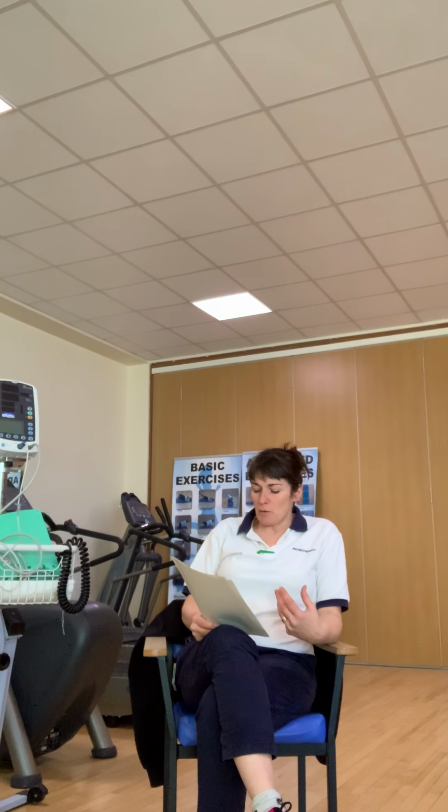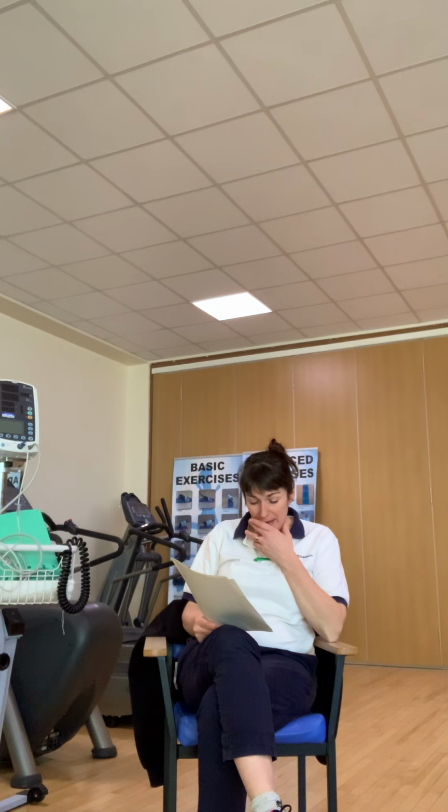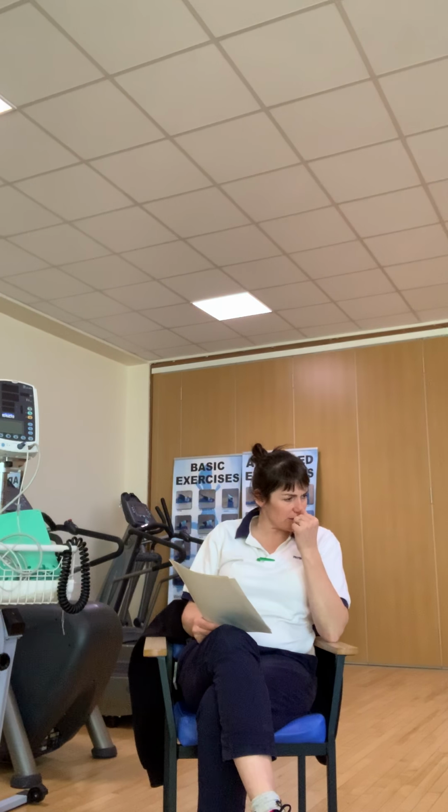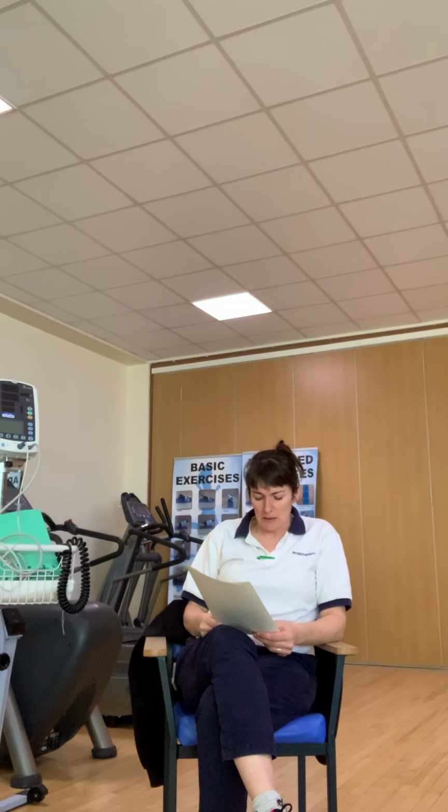Temperature. We all know the effects of temperature, sepsis, etc. Normal temperature is around 37 degrees Celsius. Fever is usually when your body temperature is 38 or higher. I think the COVID guidelines at the moment for temp are 37.8, and it's on all the ward desks everywhere. I will try and show you how you take a temperature, but some of this we will have to do in situ. We haven't got a temp machine down here, but we'll cover that while we're working.